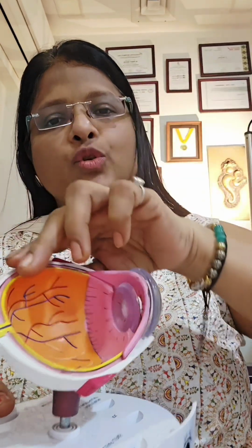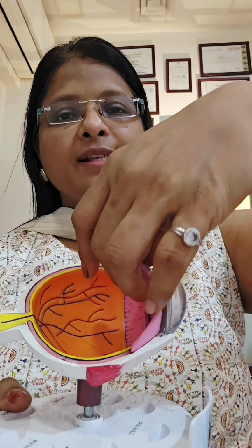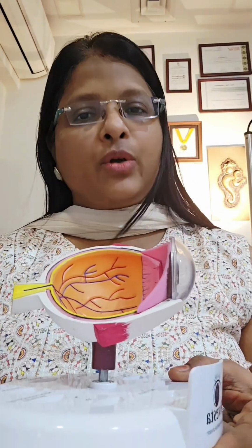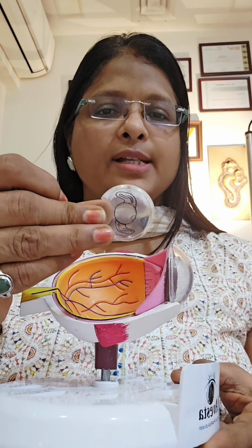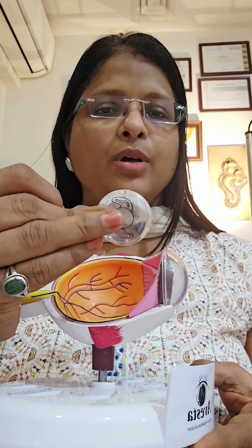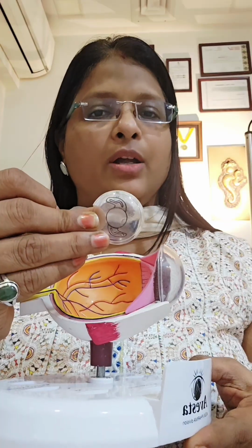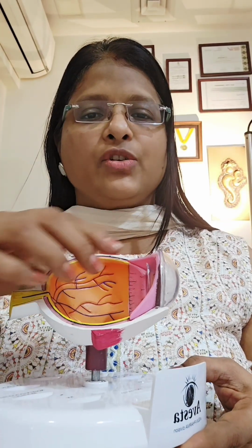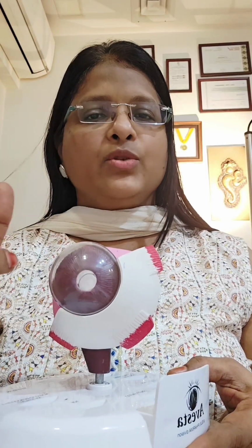Okay, so it is this lens that we remove and we place an artificial lens which is known as intraocular lens. So this you can see inside over here, this is the intraocular lens, the central round black portion and the two fang-like parts. So this is an intraocular lens or an IOL. So this is the lens which we place in the eye in this position, and this is the area through which we see.